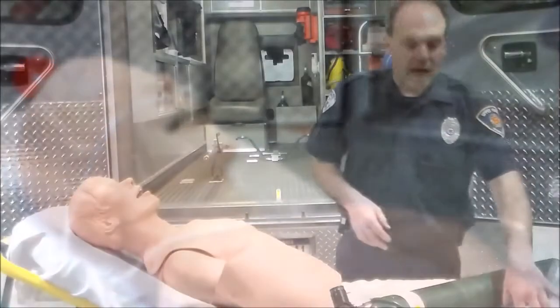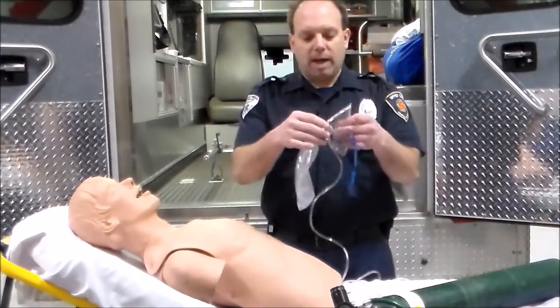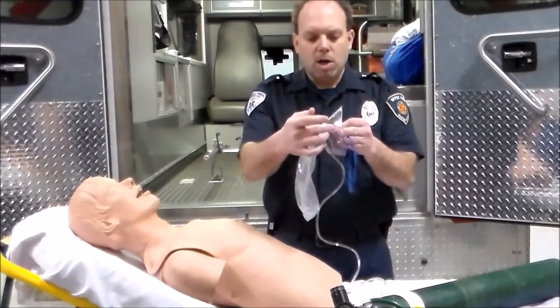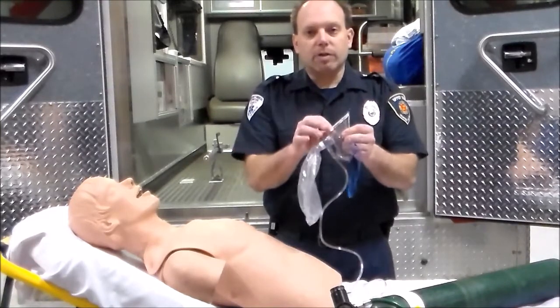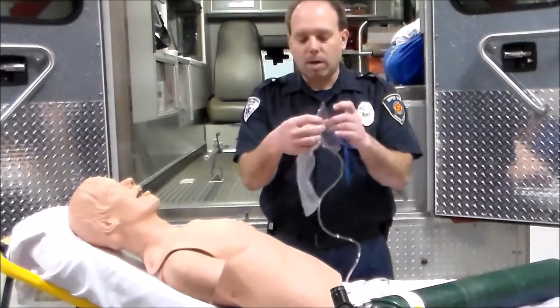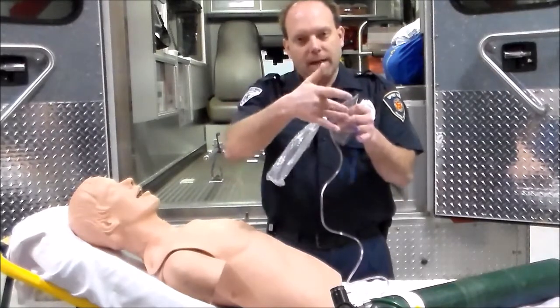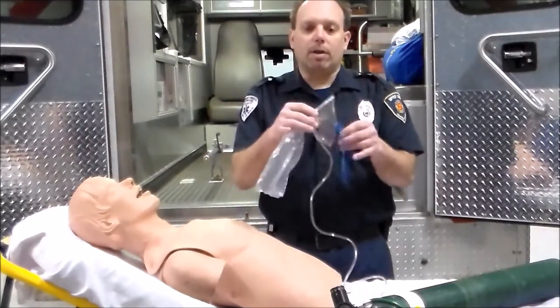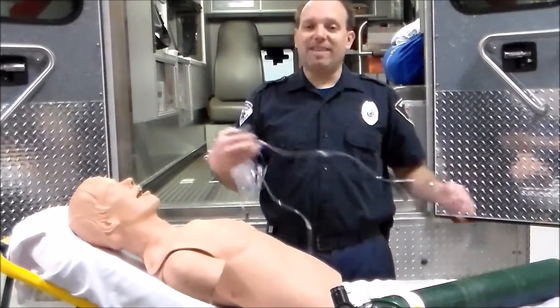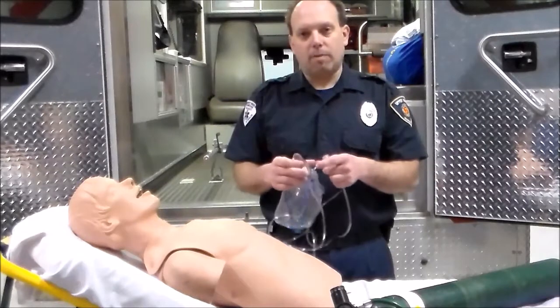We're also going to utilize a non-rebreather mask. A non-rebreather mask is designed to allow the patient to not breathe in as much ambient air. There are some little side ports, and some models have little rubber pieces that can be adjusted to make it a partial rebreather. Oxygen flows in, and the patient exhales carbon dioxide out. For our patients, this starts at a liter flow of 10 liters. When we place the non-rebreather on them, we then check the bag.